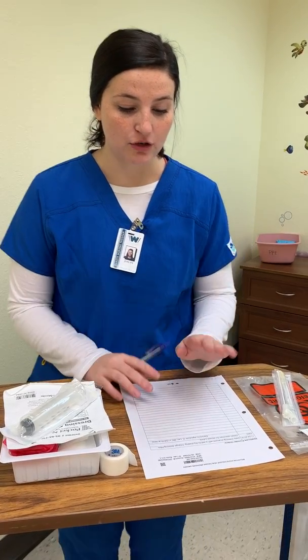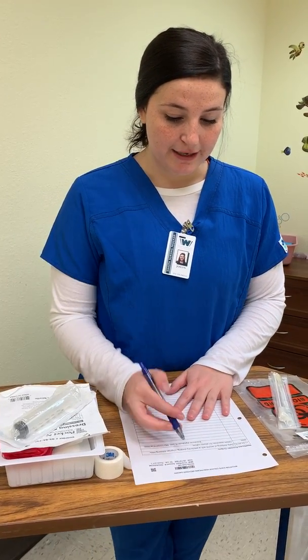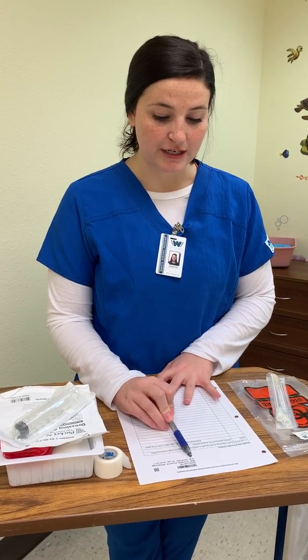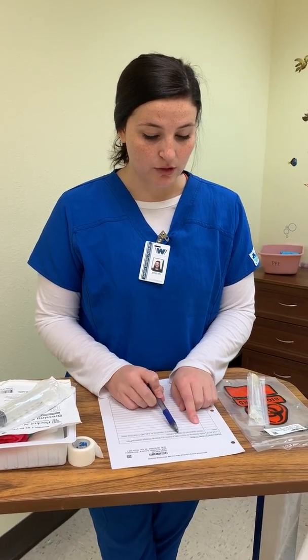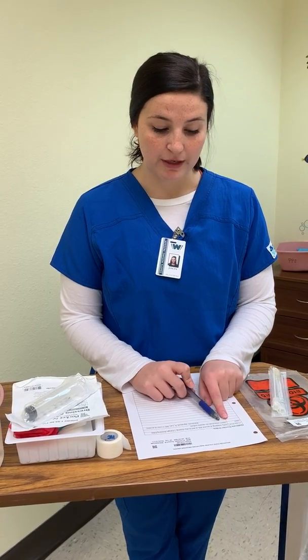So to begin, I'm in my med room, and I'm just going to look over my provider's orders. It looks like I'm working with Shirley Coast. Her date of birth is 5/14/1964. Dr. Leo has ordered daily dressing of wound with a wet to dry dressing, change PRN. At 0900, we're going to obtain a specimen for wound culture as well.